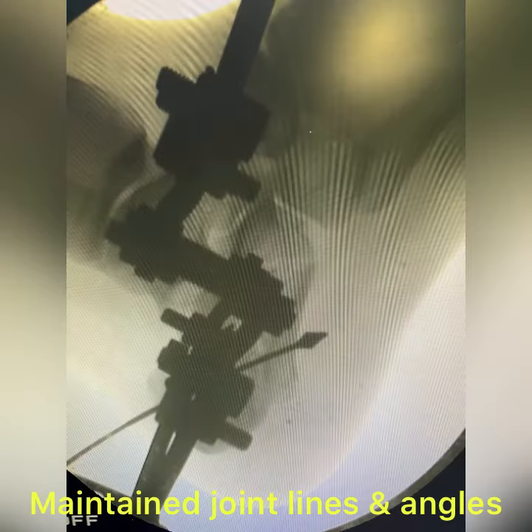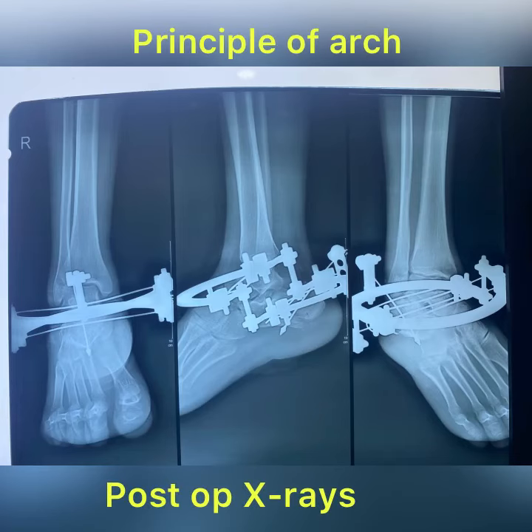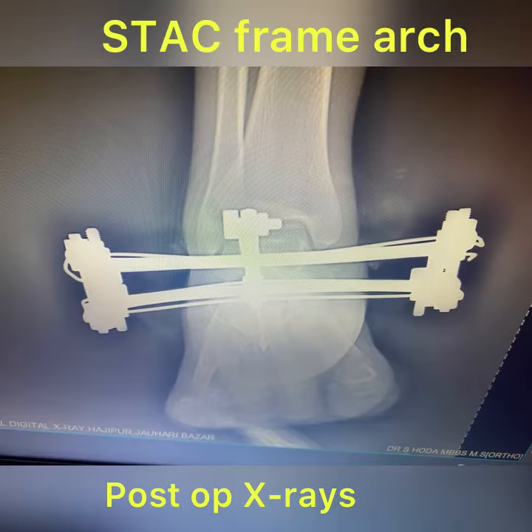You can see here, these are the post-op x-rays. As you can see, the arch is there. The joint lines are well maintained. Free movements are there. And this is the olive to maintain the fracture. This is the arch that maintains the ligamentotaxis.